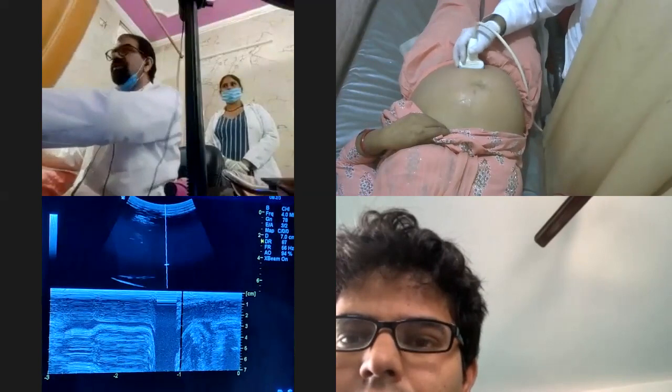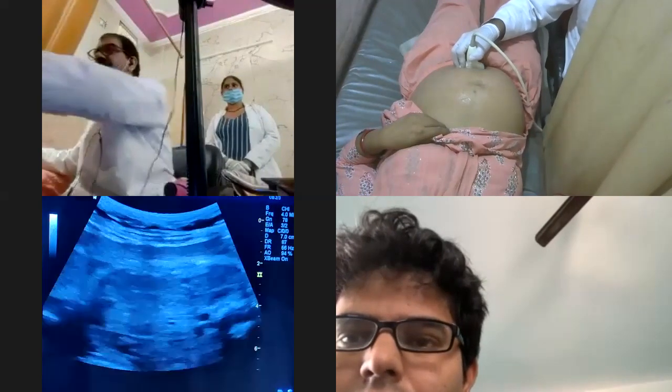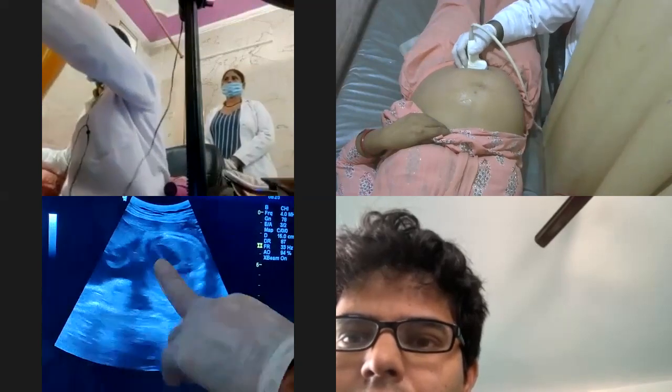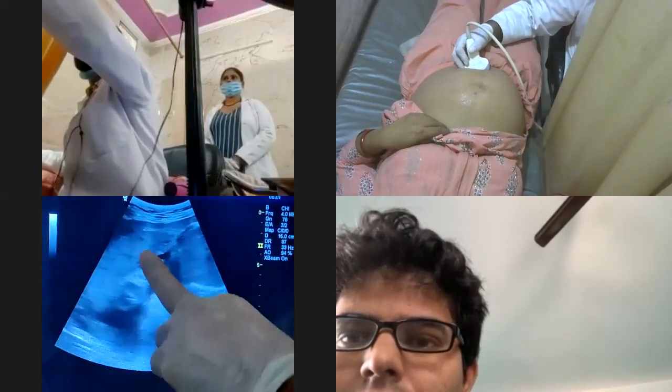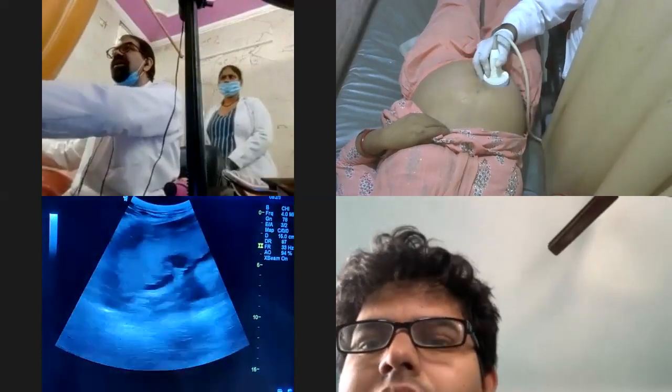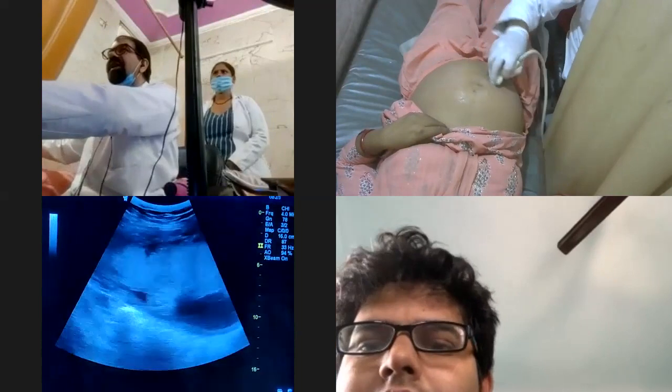Now, where is the placenta? Dr. Ablesh will tell me where is the placenta. See, this is the abdominal circumference. This is the heart over here. This is the amniotic fluid. This is the placenta. Now, is this placenta anterior or posterior? And give me the grading of the placenta.